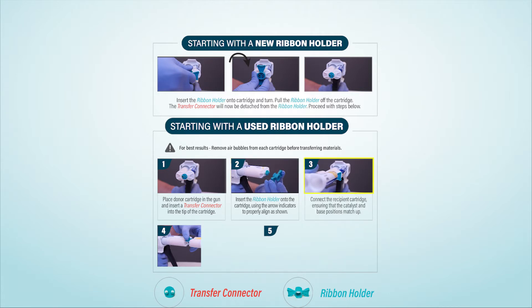Connect the recipient cartridge, ensuring that the catalyst and base positions match up. Rotate the ribbon holder to lock the two cartridges together.